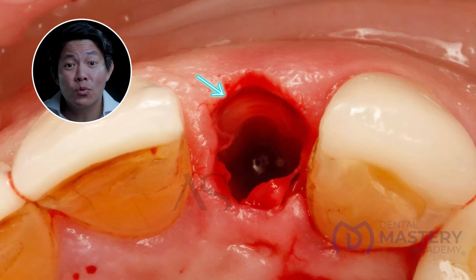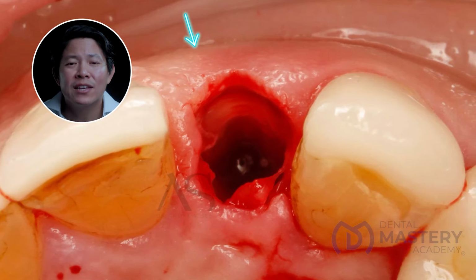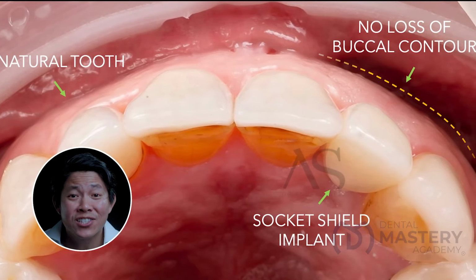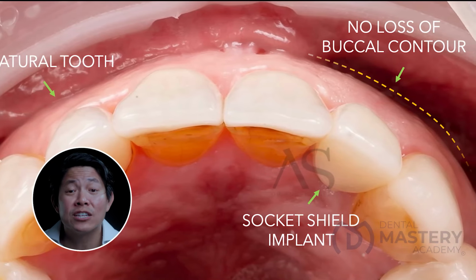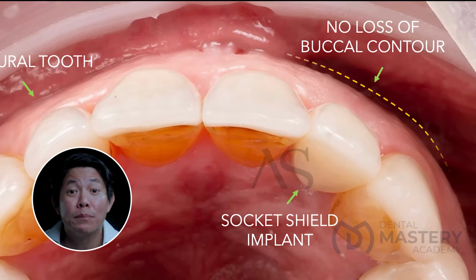Now, what is the socket shield technique? The socket shield technique allows us to keep a portion of the root structure intact. This helps us preserve the surrounding bone and soft tissue. This is the key factor for achieving a harmonious soft tissue outcome. This technique can make all the difference in the aesthetic zone, especially when preserving the natural contour and avoiding bone loss and subsequent soft tissue loss post-extraction.